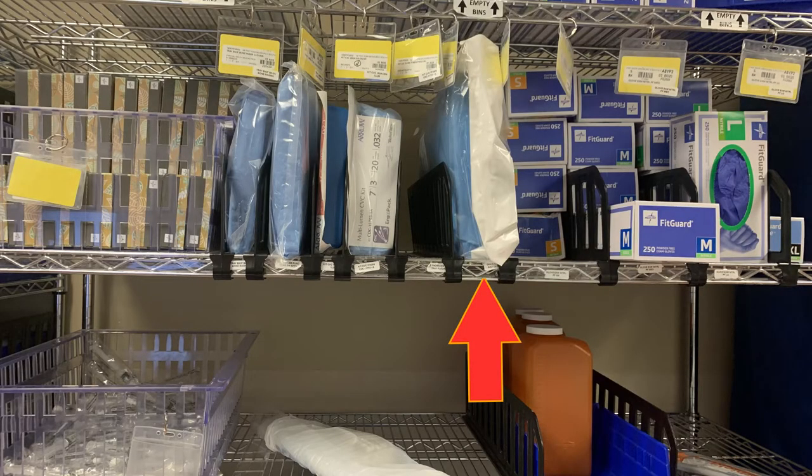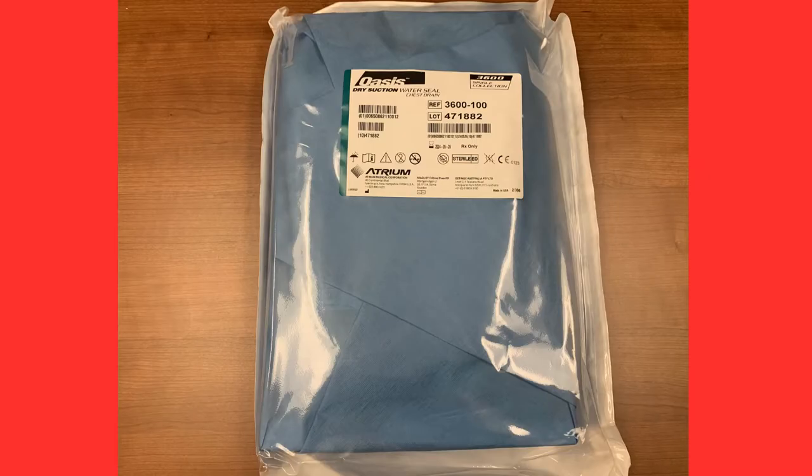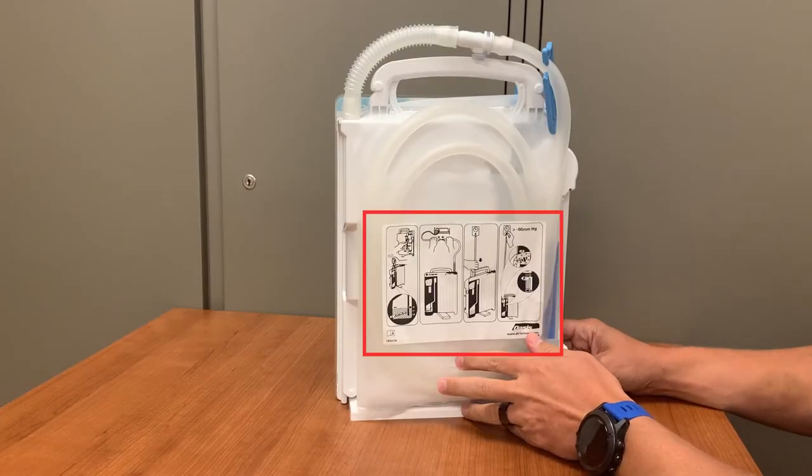The Oasis can be found in the pod rooms on all units. When opened, it will look like this. It is sterilely packaged; however, when we need to set up a new unit for a patient on the floors, aseptic technique will be used. On the back of the Oasis, simple setup instructions can be found.